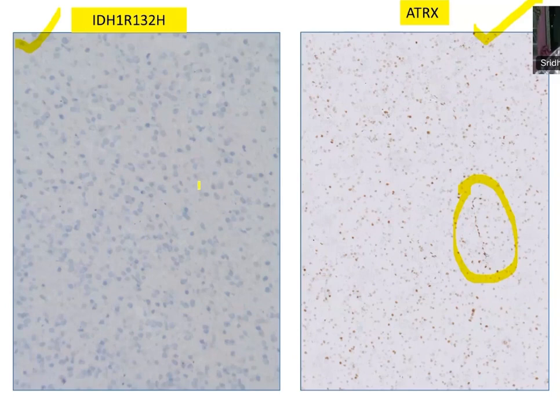You had 3 groups, right? In adult diffuse glioma: IDH mutant astrocytoma, IDH mutant oligodendroglioma, and glioblastoma, which is IDH wild type. You have not got IDH positive, so you could not decipher whether it's a mutant type or a wild type. But what you saw, ATRX is not lost, it is retained. That means it is not the phenotype of IDH mutant astrocytoma.